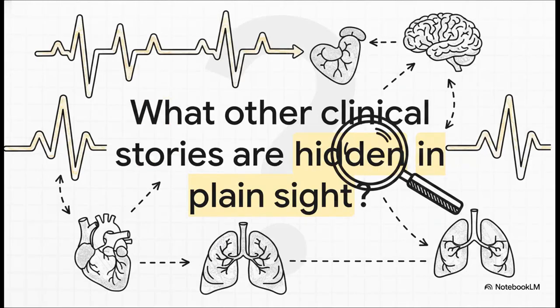We'll leave you with this thought. These 2 cases are a brilliant demonstration that an electrocardiogram is so much more than just a tracing of electrical activity. It is a rich clinical narrative. And if you have a systematic, principle-based approach, you can learn to read that story and use it to make a real, definitive difference for your patients.